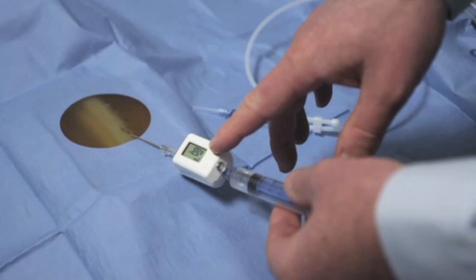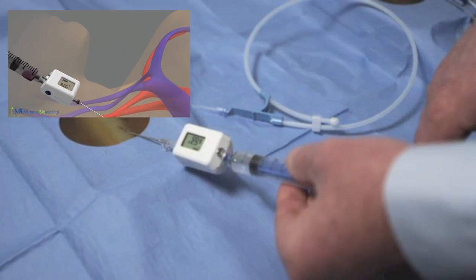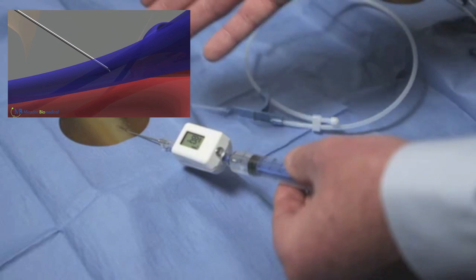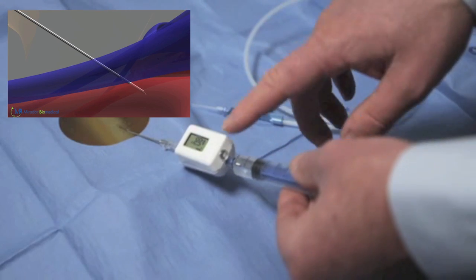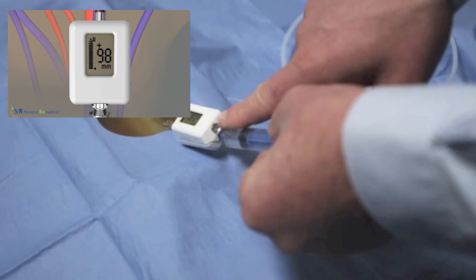So here again we see the needle tip in the venous system, and what we're going to demonstrate here is if the needle was advanced posteriorly through the wall of the venous system into the artery, and here we will see the pressure jump suddenly, displaying the arterial pressure.